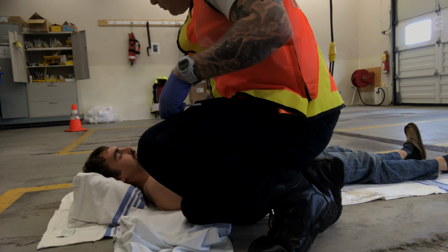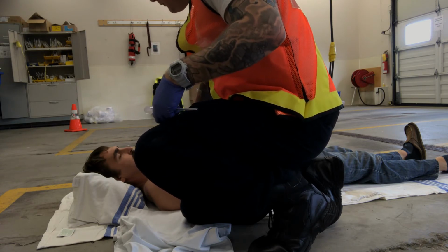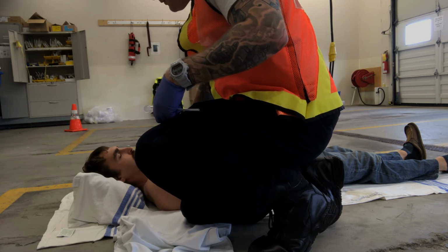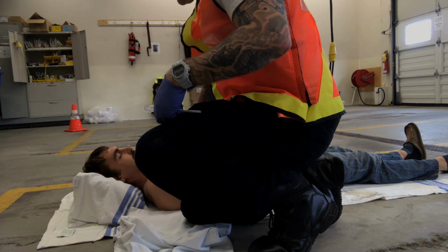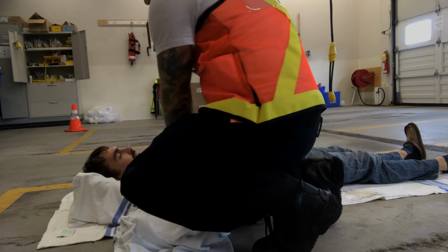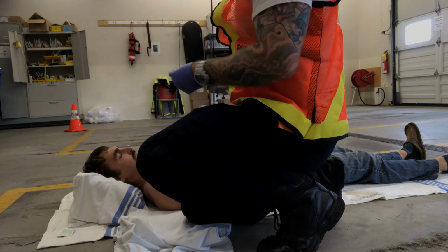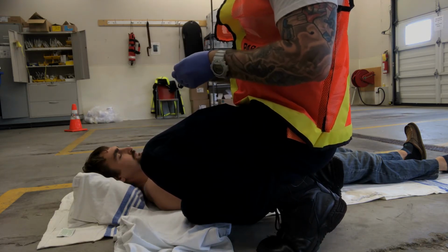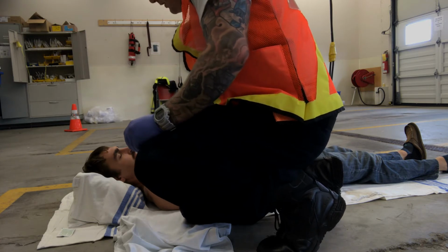First I'm going to landmark where I'm going. I'm going to the sternal notch, finding the second intercostal space. I'm going to follow that to the mid-clavicular line. I'm going to mark with my pen where that is. I'm going to take an alcohol and cleanse the site.